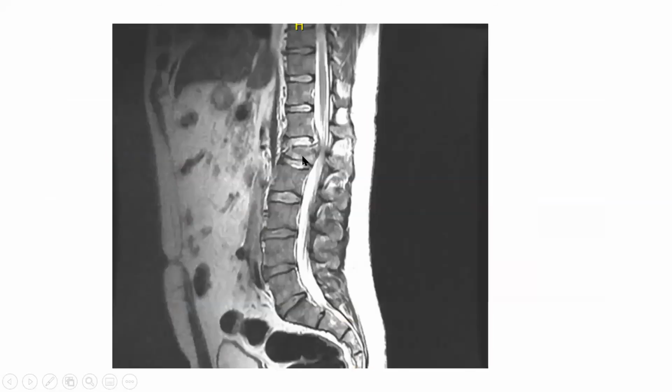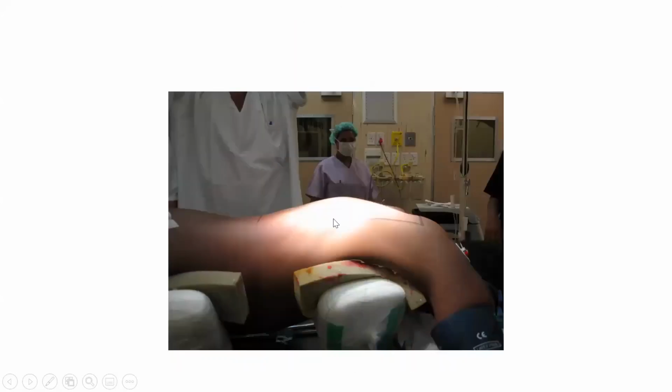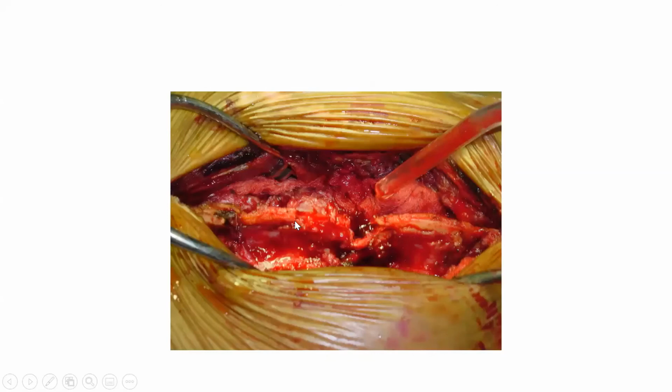So I'll show you this patient who looks like he has an unstable burst fracture. It's torn through the disc, and he's got vertebral destruction there. The ligamentum flavum looks intact here, but I made the decision to fix him. See, he's lying on the table, and you can see the kyphosis there. These are obviously different patients.